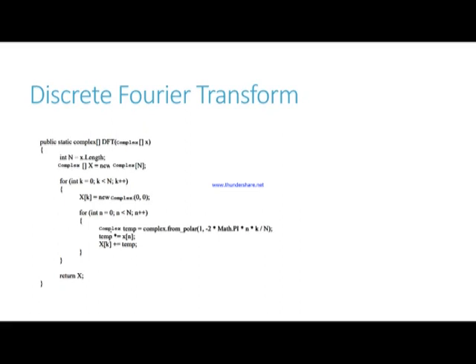While talking more about the frequency resolution, while the array returned from the Fourier Transform function is useful, it doesn't directly contain all the information that will be required to determine the actual response of a given signal. One factor to consider during the development of the Fourier Transform function is the frequency resolution of such transformation.